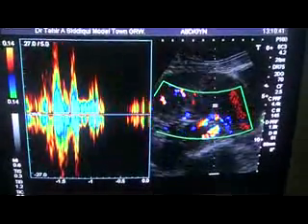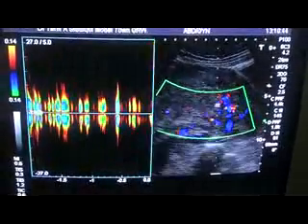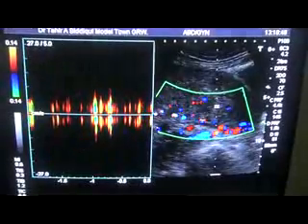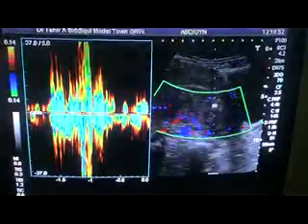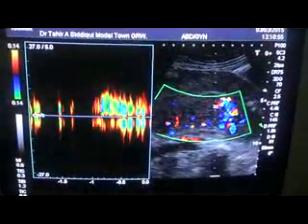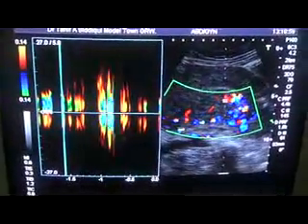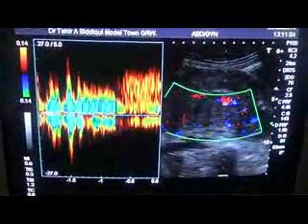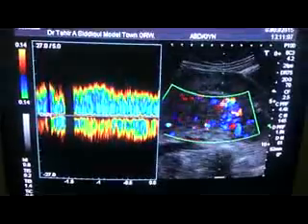I would like to get the area of interest first, and then apply this Doppler — power Doppler effect. You can see the vessels. This is an artery, as you can see by the waveform.